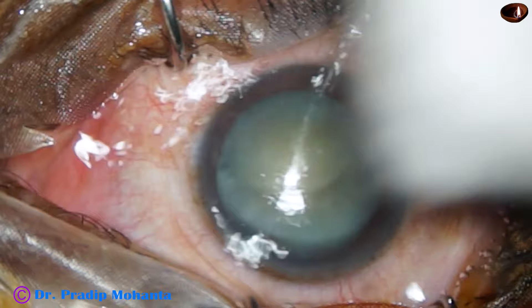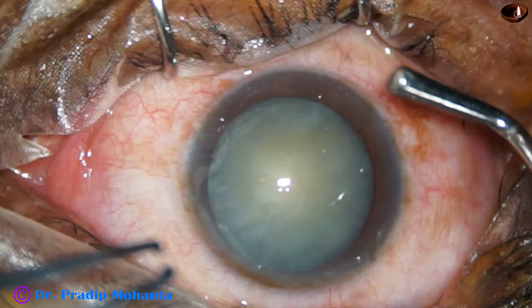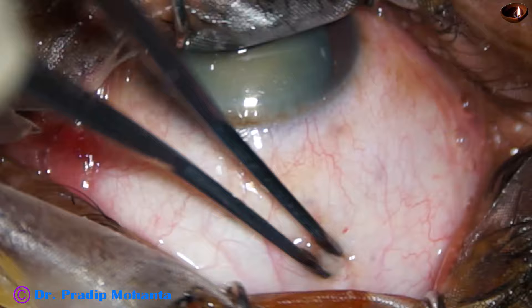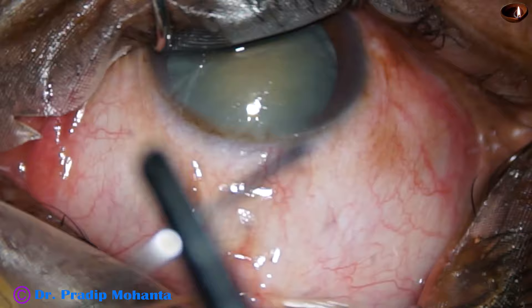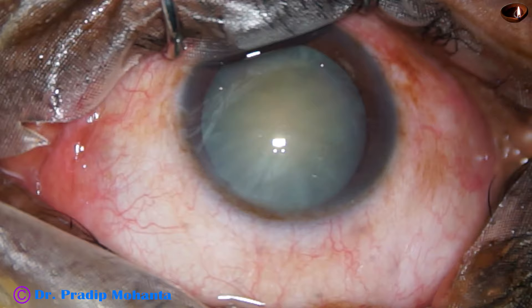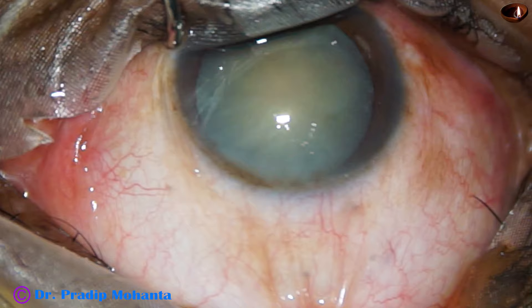Apply a few drops of povidone iodine over the ocular surface and wash the ocular surface thoroughly with Ringer's lactate or BSS. Now turn the eyeball down with a muscle hook, hold the superior rectus tendon and pass a superior rectus bridle suture. This helps a lot particularly to beginners. The bridle suture has been applied.